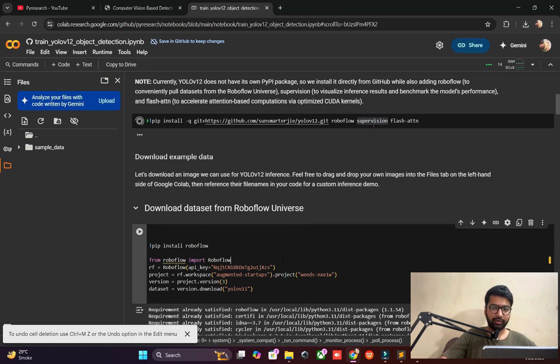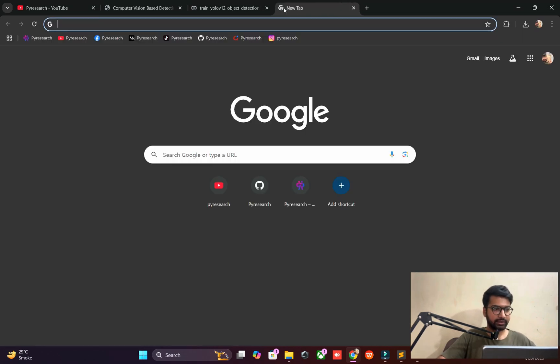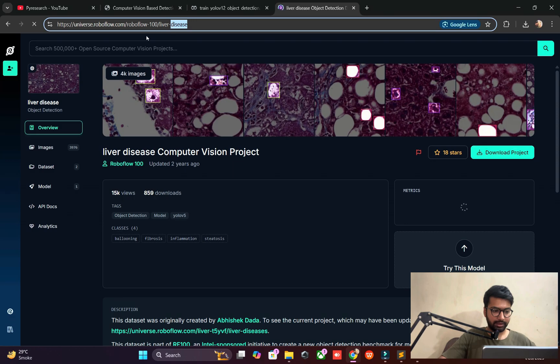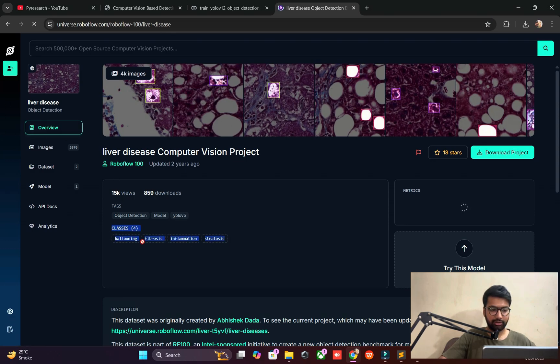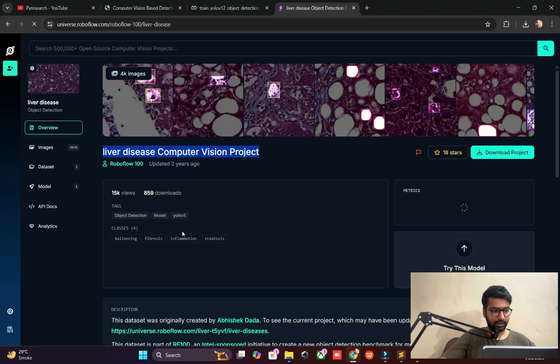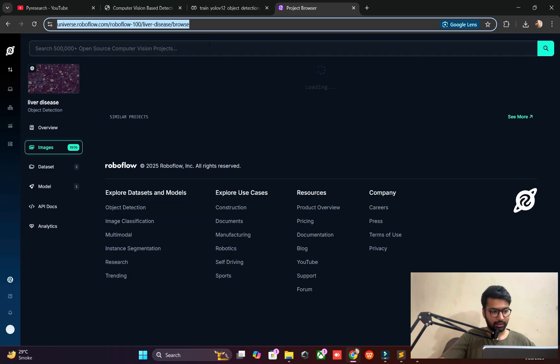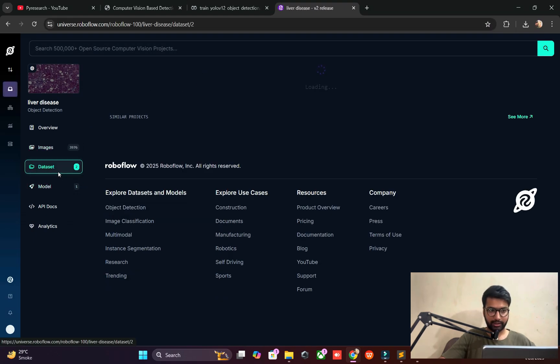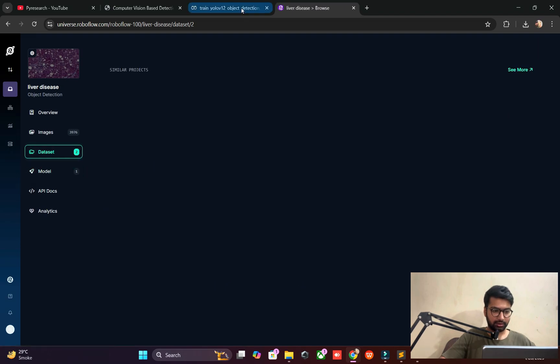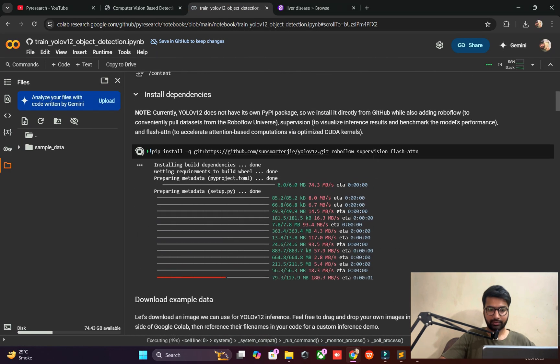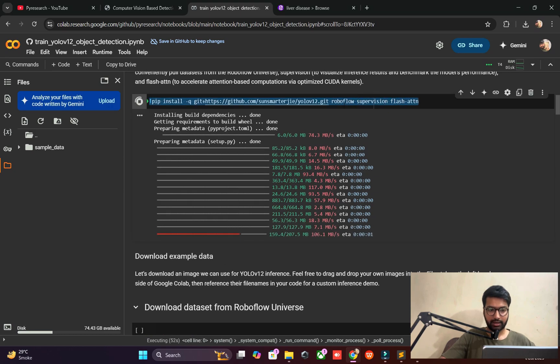We need a dataset — you can get it from Roboflow. Search for liver disease on Roboflow. Four classes are targeted: ballooning, fibrosis, inflammation, and one more. This is the liver disease detector. The images already have annotations — this is an open source platform and no one can claim issues with using this dataset.